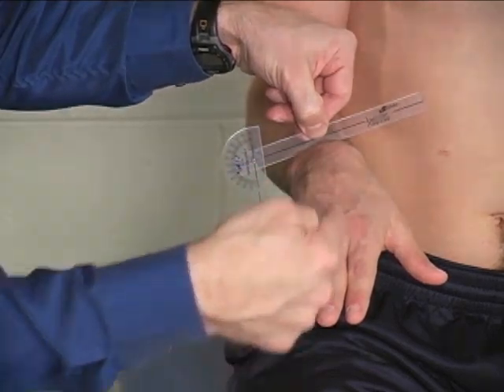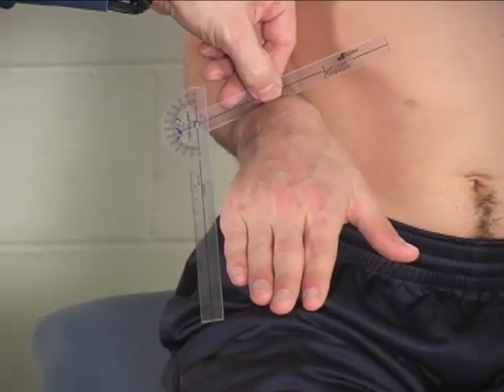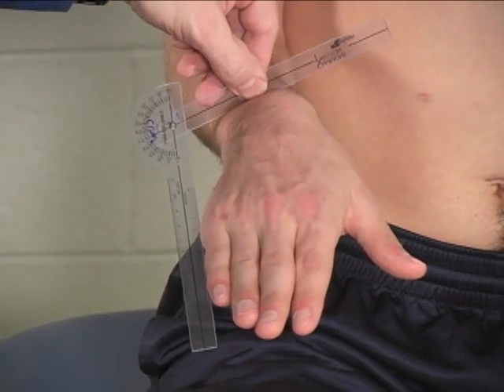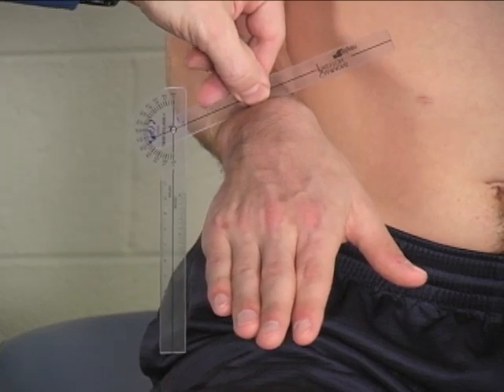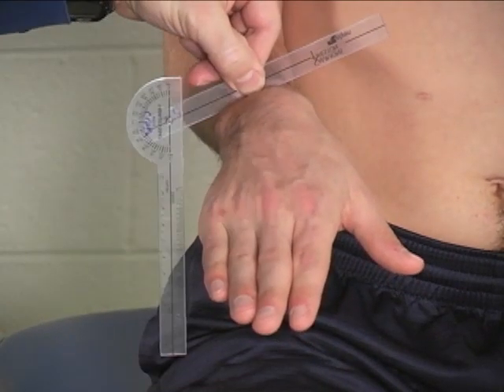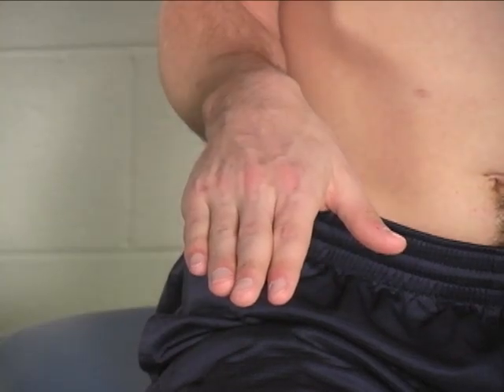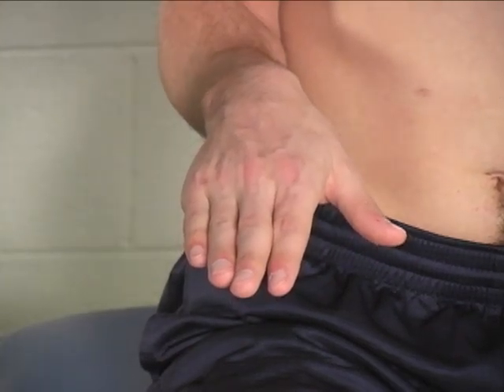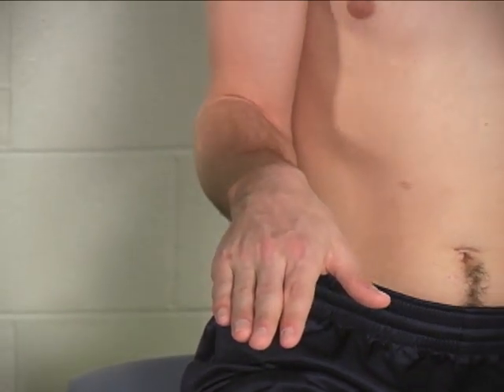The axis is in line with the long axis of the forearm and the stationary arm is simply kept vertical — you may want to eyeball that so you can see that it's actually vertical. In this case we have pronation, active range of motion of 0 to 65 degrees.